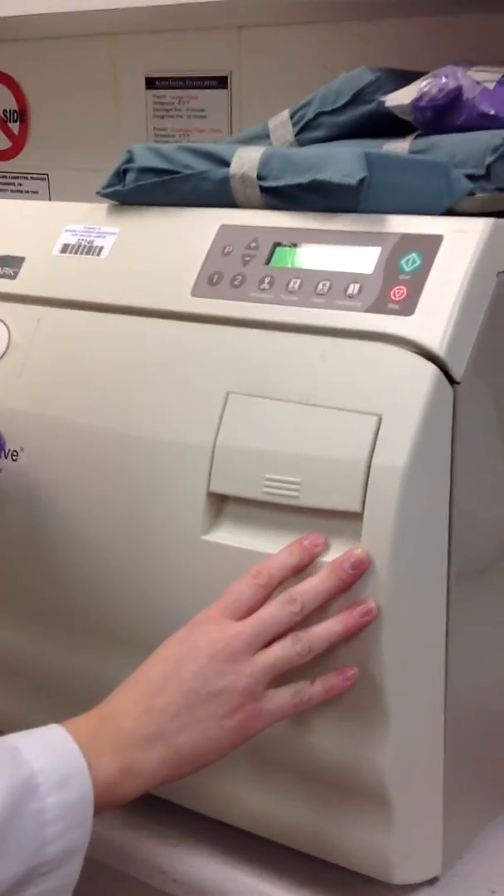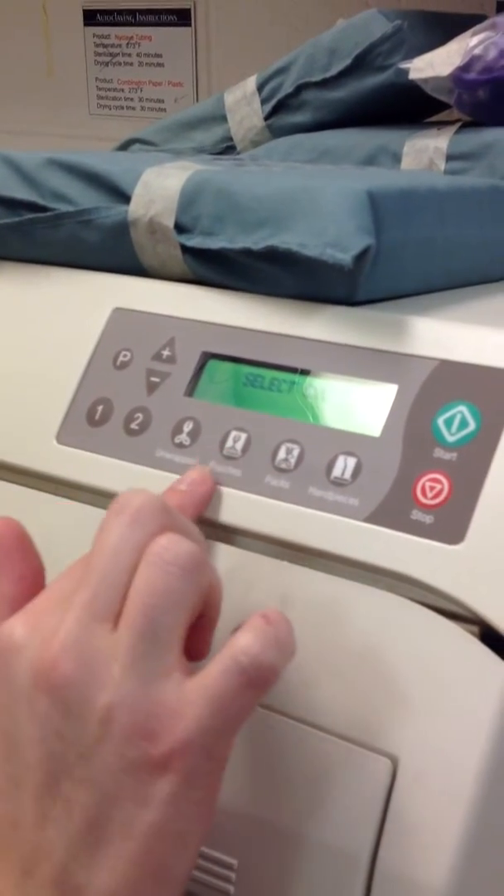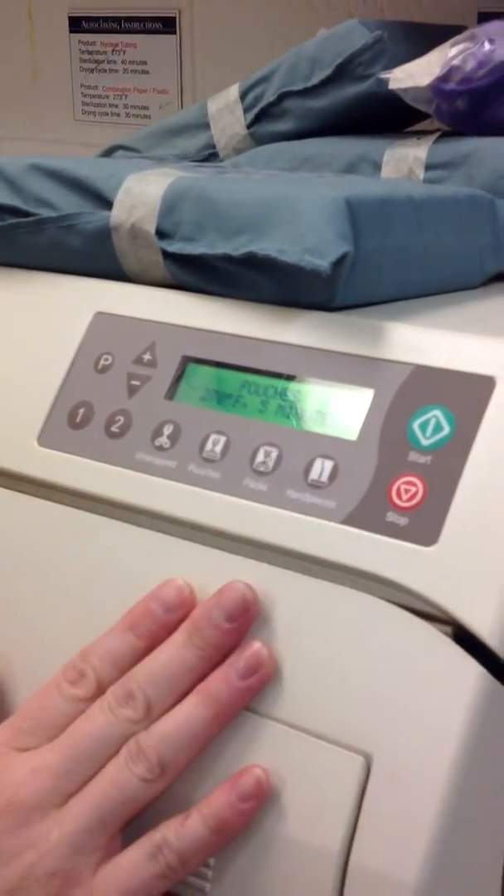Once it's locked, you're going to come up to the control panel. You'll select either pouches or packs — doesn't really matter — and you'll hit start.